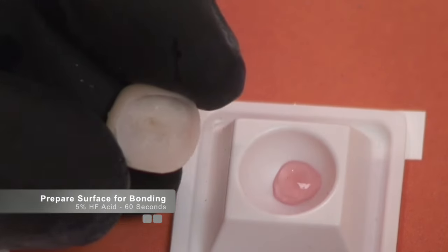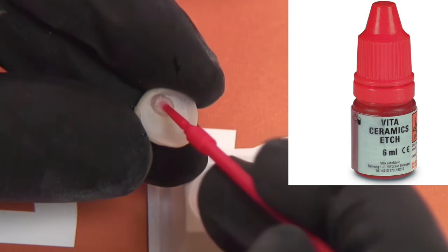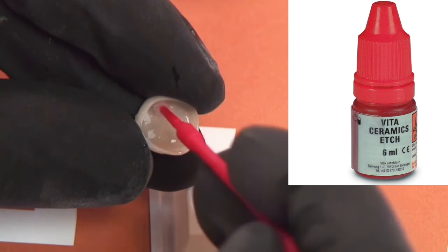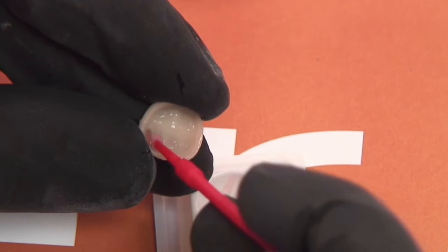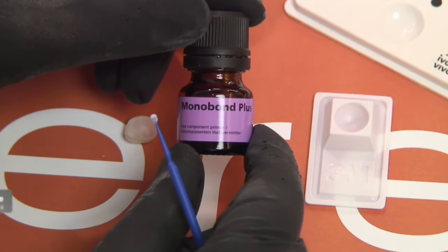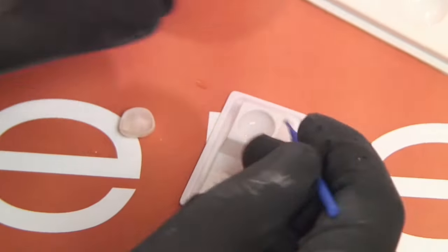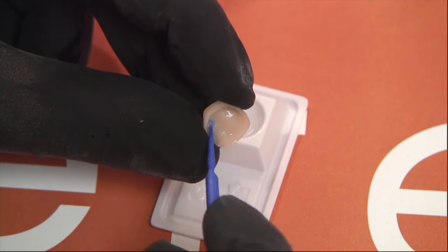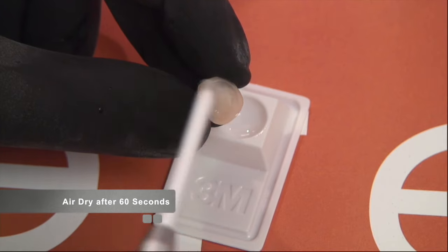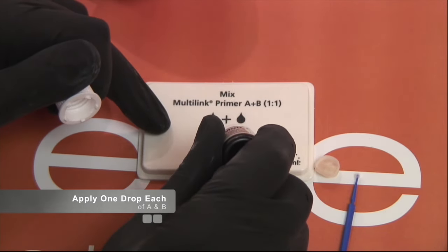The Enamic has been polished and fitted to our preparation. Now we need to prepare the inside surface. Because this is a mostly ceramic material, we're going to apply 5% Vita hydrofluoric acid to the internal surface, let it sit for 60 seconds, then rinse. The hydrofluoric acid mechanically prepares that surface for bonding. After hydrofluoric acid etch, we apply the mono bond silane — the silane chemically prepares the surface for bonding. Apply it to the inside of the restoration, let it sit for about 60 seconds, then air dry.